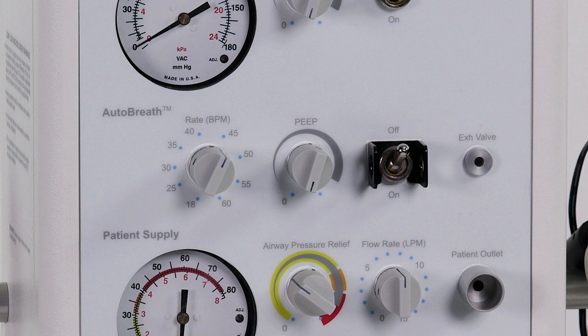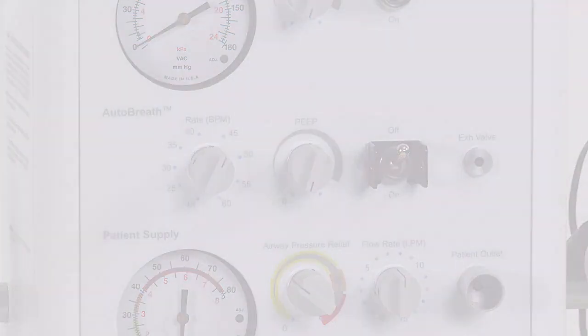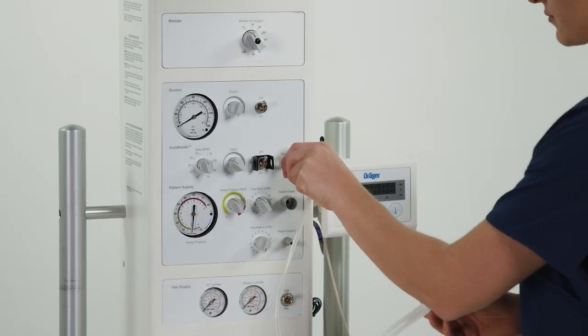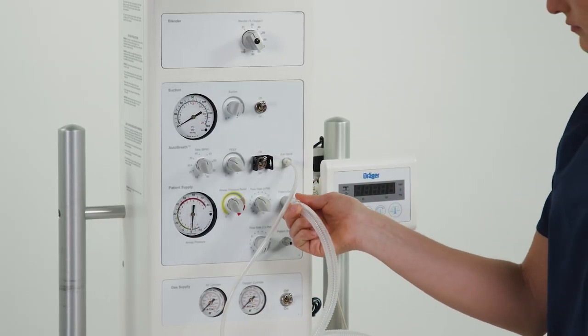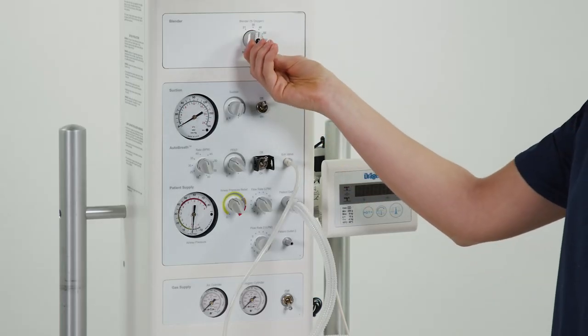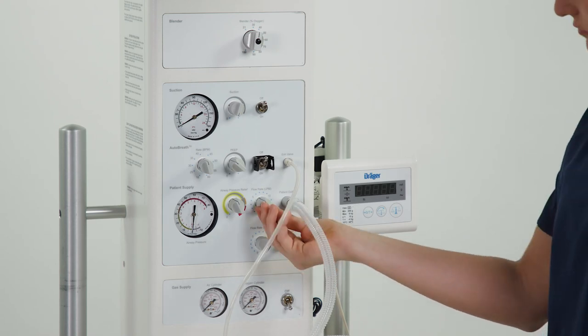Auto breath resuscitation. Auto breath is a key advantage of Dräger Resuscitaire. Connect the patient outlet and the exhalation valve. Turn on the auto breath module. Set the desired FiO2. Set the desired flow.